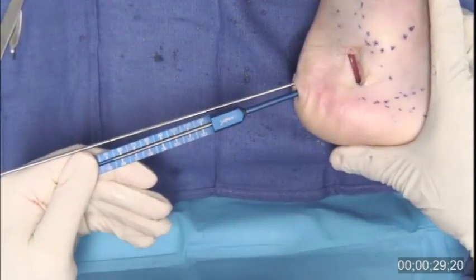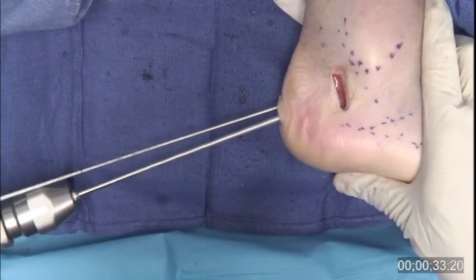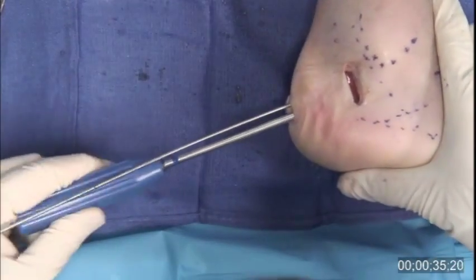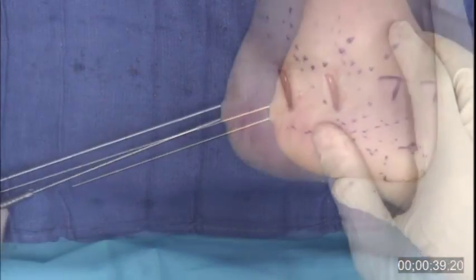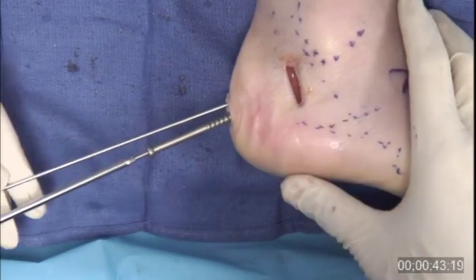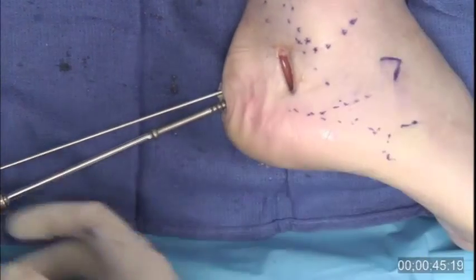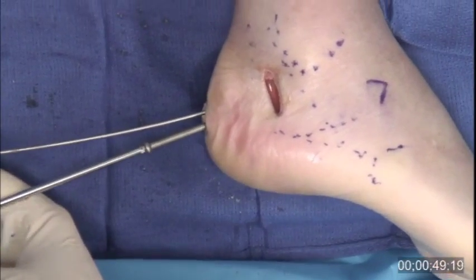The near cortex of the calcaneal tuberosity is drilled and countersunk. The Arthrex 6.7 millimeter cannulated screws are ideal for calcaneal osteotomy fixation. The thread pitch and depth maximize compression and pullout strength. The low profile head minimizes hardware irritation and the need for subsequent removal.